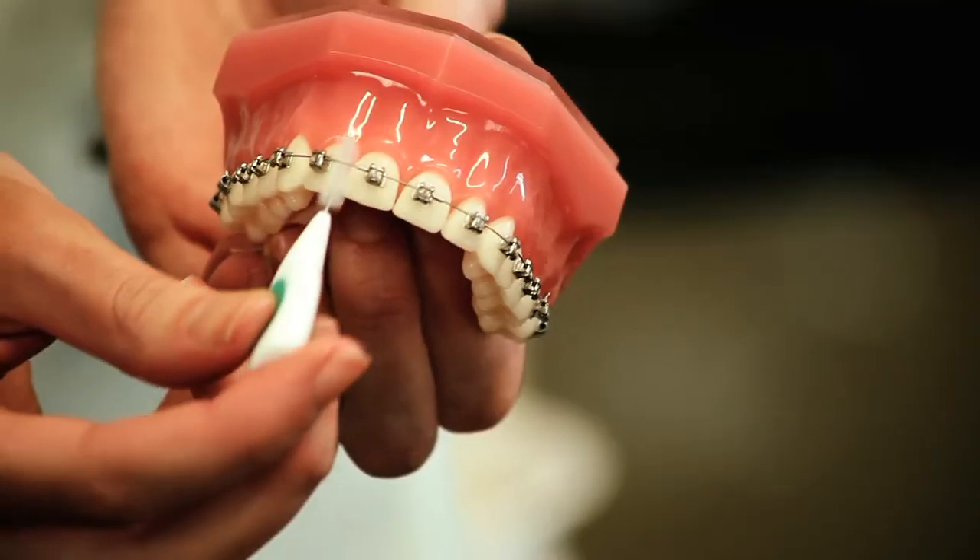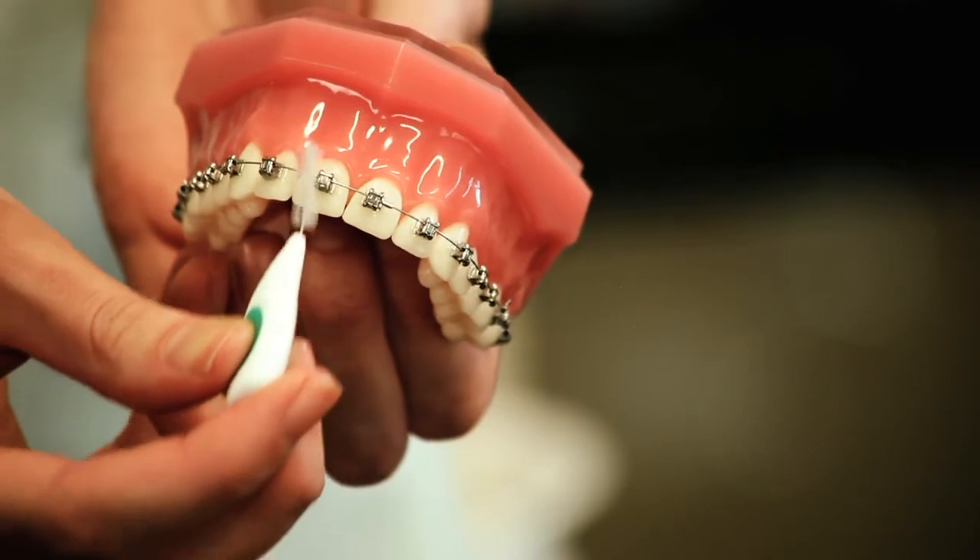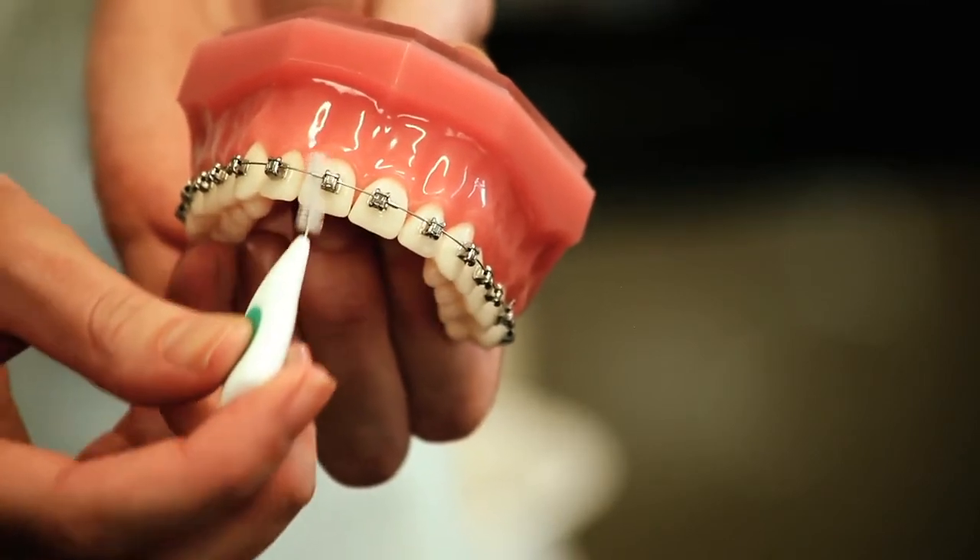You will also need to use interdental brushes, which you will find in your pack. These get right underneath the wire, which is the most commonly missed area. You need to use toothpaste on the tip and clean in every space underneath. You can continue to floss by threading it under the brace using a nylon needle.